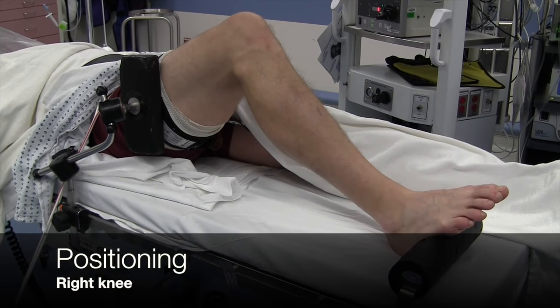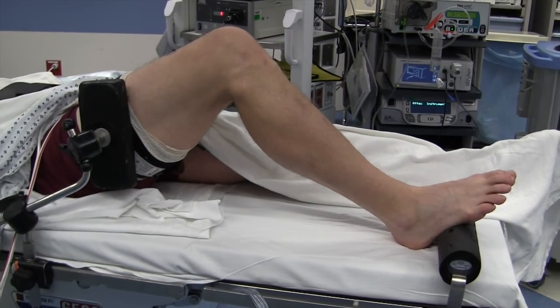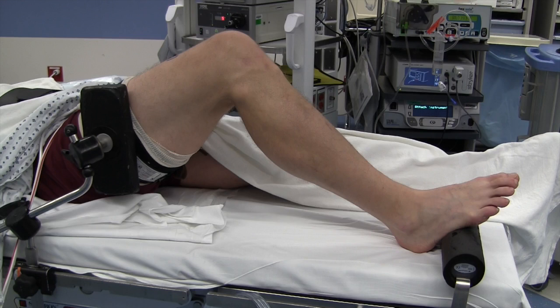The patient is positioned supine on the operating room table. A well-padded tourniquet is placed as high as possible above the thigh. A foot roll is placed in position to keep the knee at approximately 90 degrees of knee flexion. A lateral post is then positioned at the level of the tourniquet with the knee flexed.